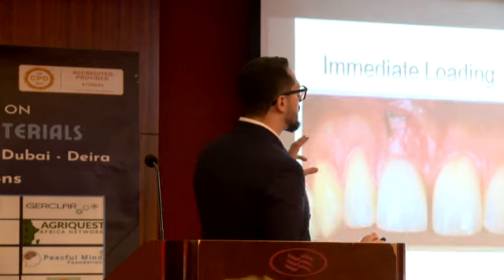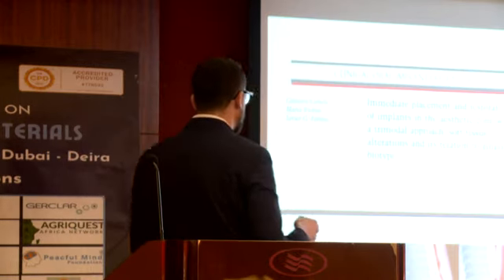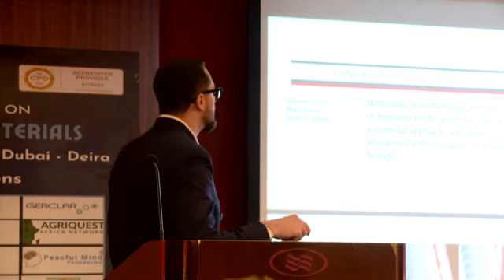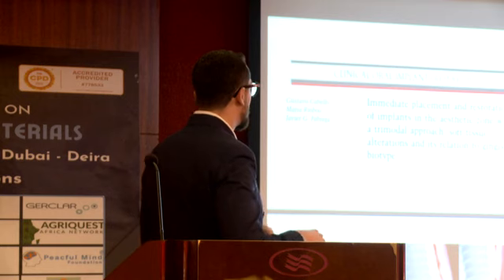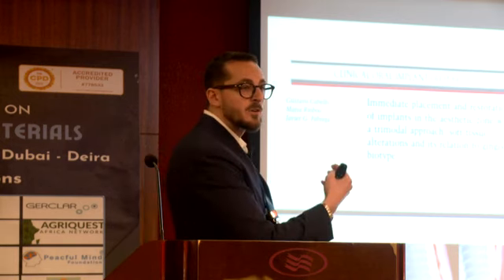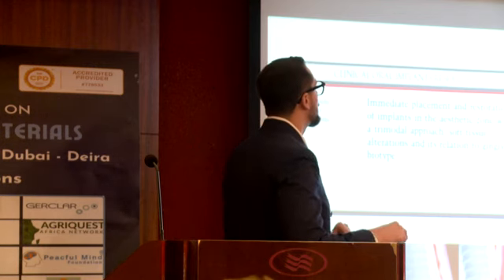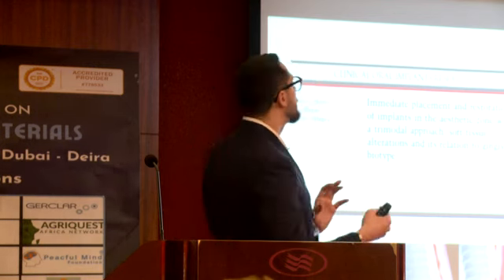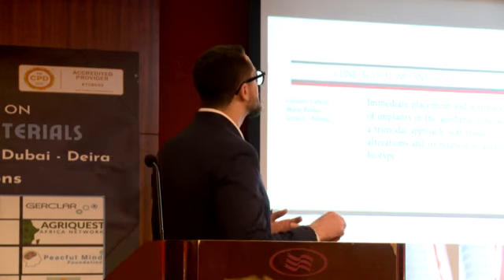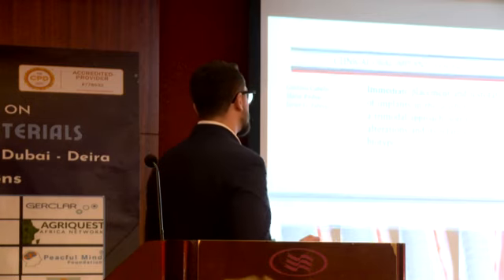And the most important concept, we have an interesting paper from Cabello that well explains the effect of the immediate restoration in comparison to just a healing cap. With a healing cap, all the soft tissue is migrating into the socket. While, due to inhibition by contact with the immediate restoration, we are avoiding the migration of the soft tissue into the socket. And this is the concept of the restorative tissue inhibitor capacity of our immediate restoration.